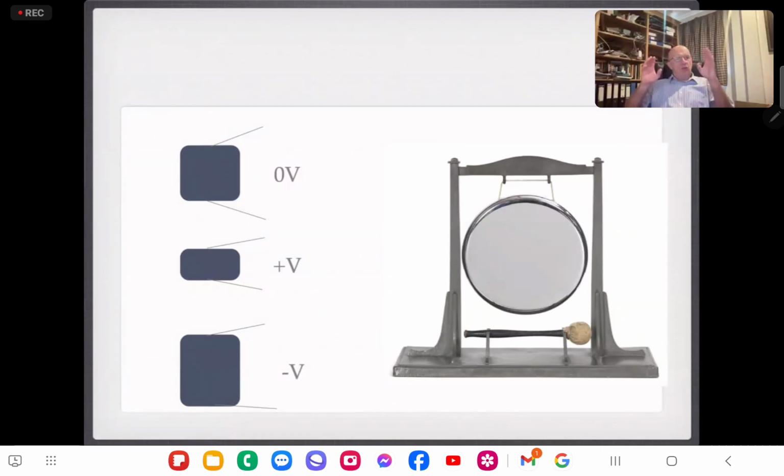In the head of the probe, whatever kind of probe it is, there's a series of crystals. And it's the crystals that make the ultrasound. How should you think of the crystals? You should think of them like a gong. So that's a picture that should be in your mind. Because if you hit a gong, it makes a note. If you hit a gong, it goes dong. If you hit a gong again, but harder, same gong, but harder, it goes dong. It makes the same noise, but louder.